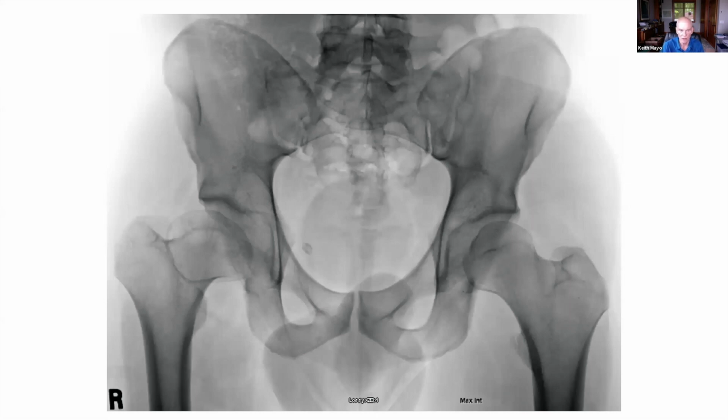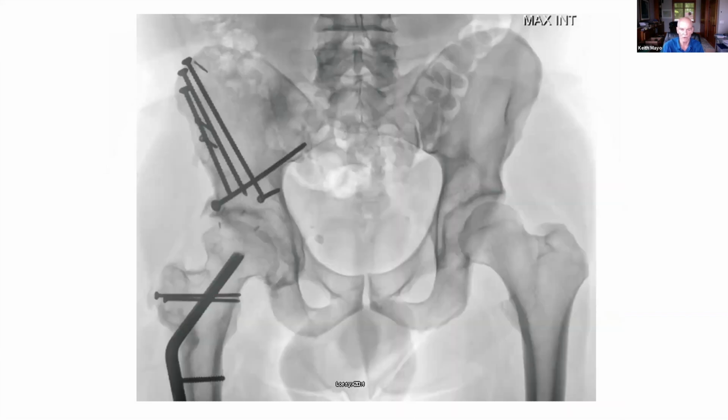You can lengthen the femoral neck on an absolute sense. I'm not going to do relative neck lengthening, but you can do a trochanteric osteotomy. You can then follow that with a surgical dislocation of the hip. You're going to do an oblique osteotomy of varying obliquities, which will allow you to essentially laterally translate the shaft and give you a medial neck. And this is an example of what one of those looks like combined with the periacetabular osteotomy. We've got about 25% shaft offset in this setting.